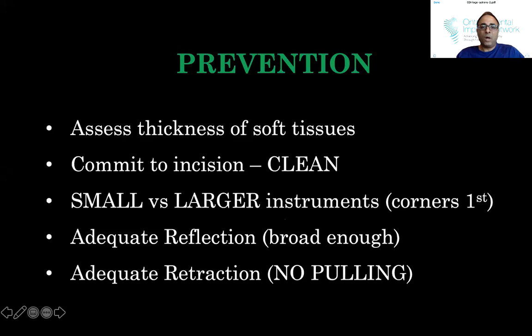Also, we want to use small instruments when we're initially reflecting, and larger instruments for broader reflection. Adequate reflection is very, very important. In fact, I stress to make sure most doctors are spending more time on this than even the implant placement, to be honest with you. Adequate reflection, and retraction, is important as well.